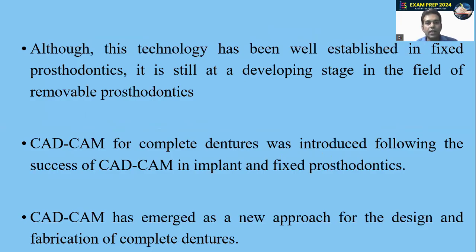Although this technology has been well established in fixed prosthodontics, it is still at a developing stage in the field of removable prosthodontics. CAD CAM for complete dentures was introduced following the success of CAD CAM in implant and fixed prosthodontics. CAD CAM has emerged as a new approach for design and fabrication of complete dentures.